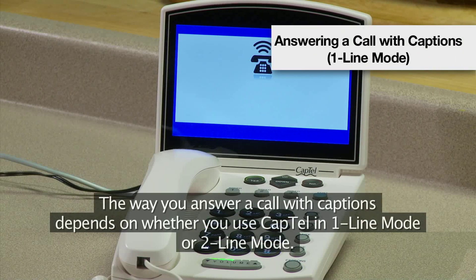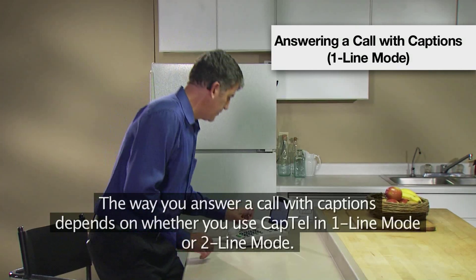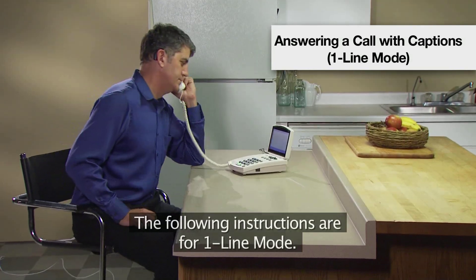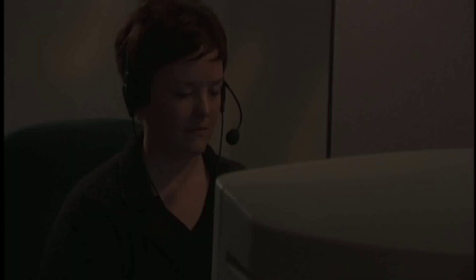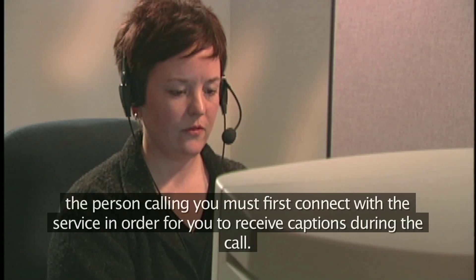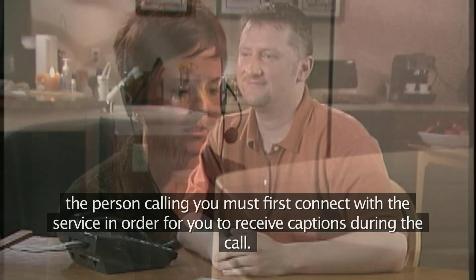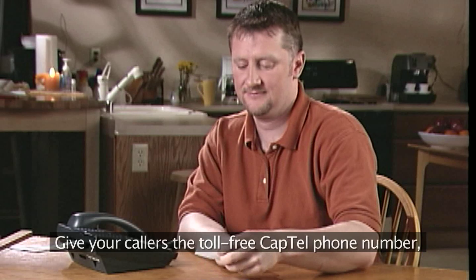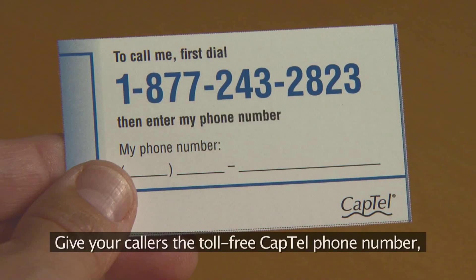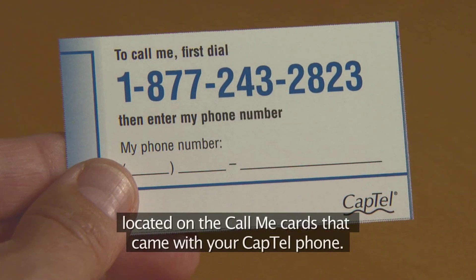The way you answer a call with captions depends on whether you use CapTel in one-line mode or two-line mode. The following instructions are for one-line mode. Because captions are provided by a captioning service, the person calling you must first connect with the service in order for you to receive captions during the call. Give your callers the toll-free CapTel phone number, located on the Call Me cards that came with your CapTel phone.